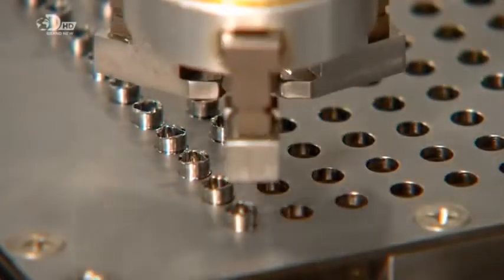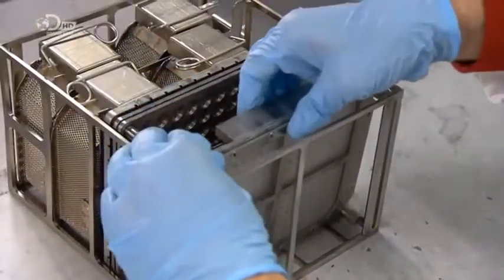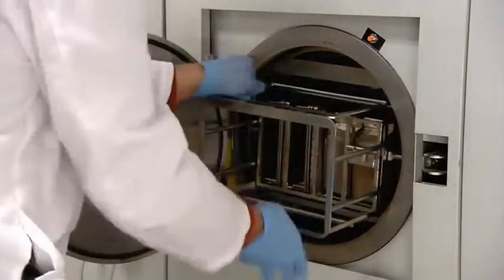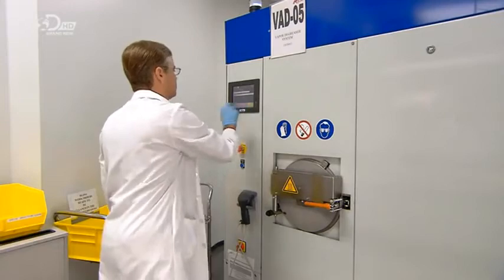Once filled with implants, a technician screws a mesh lid on the tray and slides it into a metal basket. This holds them steady for cleaning in a special washing machine known as a vapor degreaser. Inside, solvent vapors envelop the parts to clean off residual lubricant oils used during the cutting process.